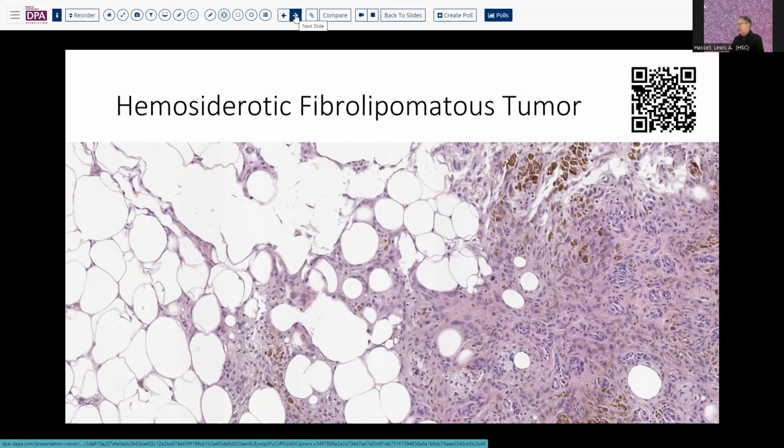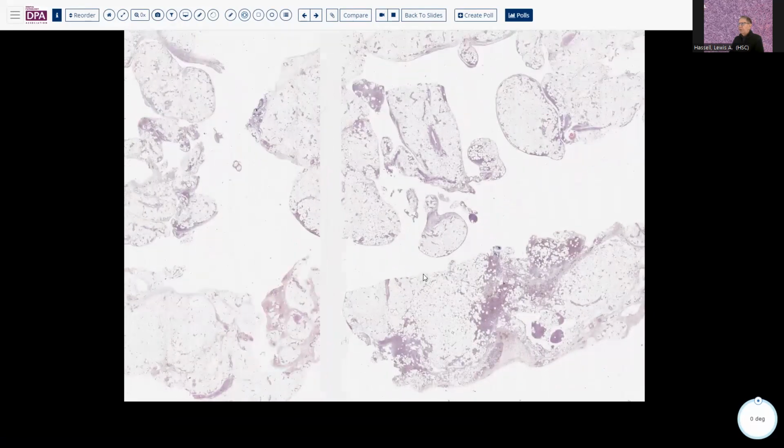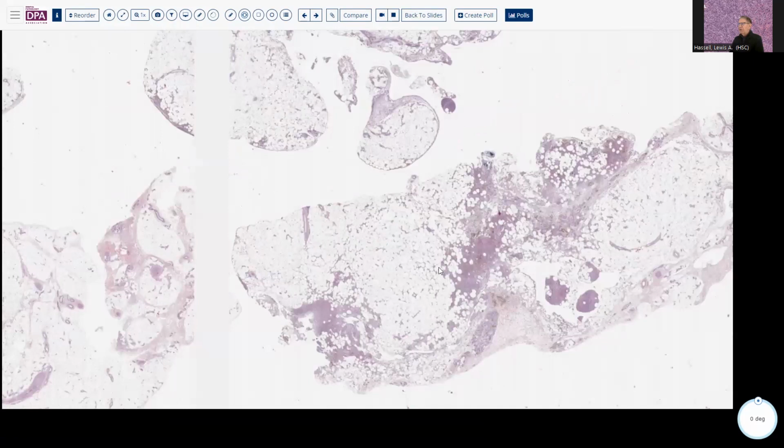The differential diagnosis includes the plexiform fibrohistiocytic tumor and giant cell tumor of soft parts, which can also have fair amounts of hemosiderin deposition and some of this sort of pattern in fat. You might also consider, especially if it involves the superficial tissues, dermatofibrosarcoma protuberans, which can also occasionally have these histiocyte-like areas and hemosiderin deposition. So I was able to find one histologic example of this lesion. So this will have to do for our instruction about the lesion.